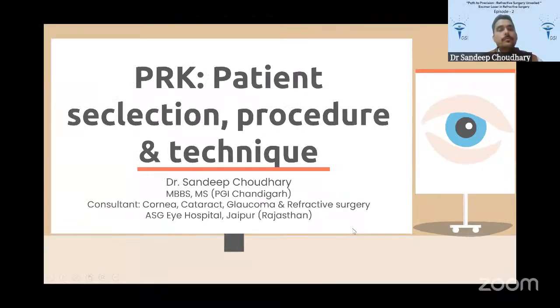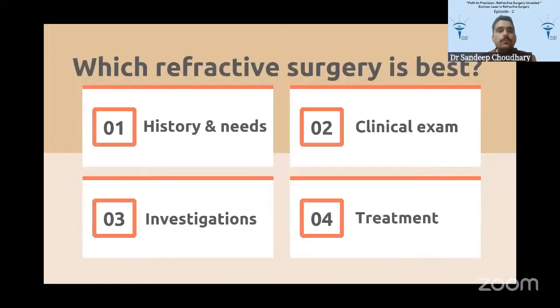Good evening, everyone. I will be discussing photorefractive keratectomy, some basics like patient selection, procedure, and the technique. With the plethora of refractive surgeries available, which refractive surgery is best is a constant debate. I think what works best in your hands, and what suits best to the patient. So we need to take into account the history and needs of the patient, what the clinical examination entails, and what the investigations tell us, and then only can we decide what's best for the patient.